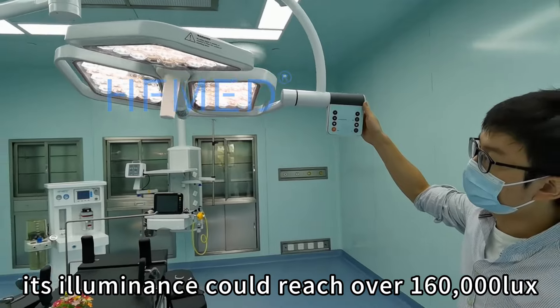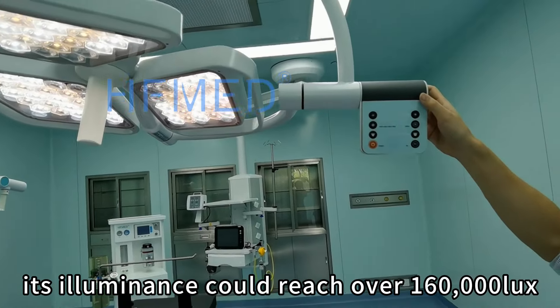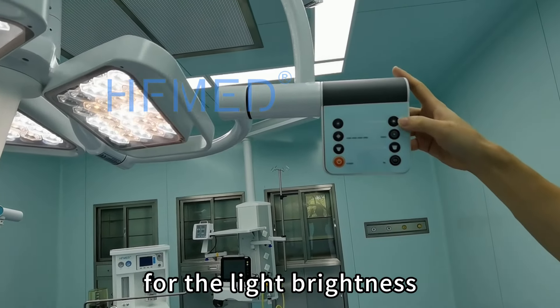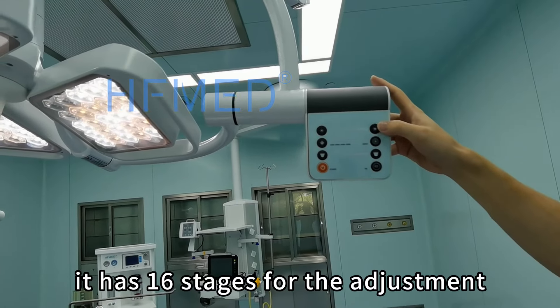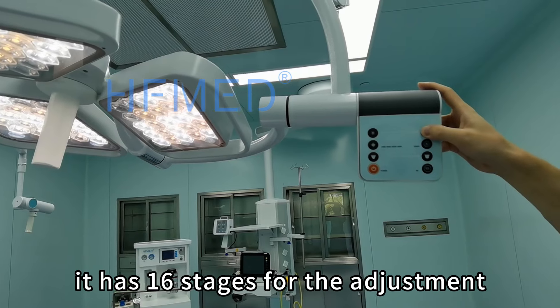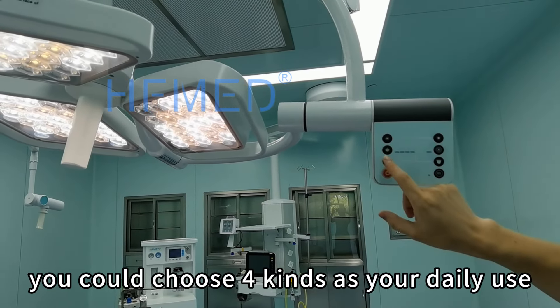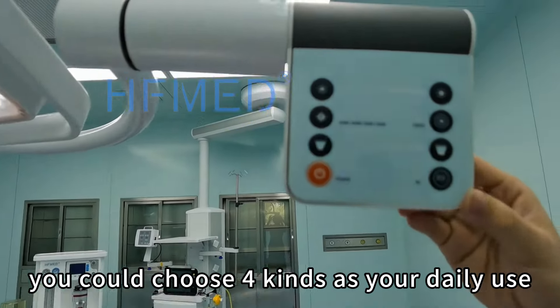For this lamp, its illuminance could reach over 160,000 lux. For the light adjustment, it has around 16 stages of adjustment. And for the color temperature, you could choose according to your daily use.